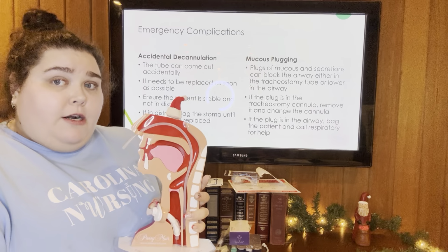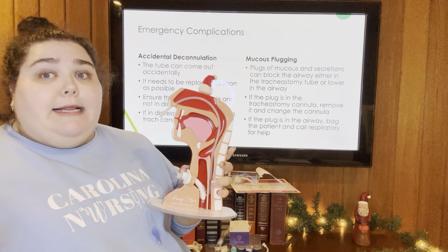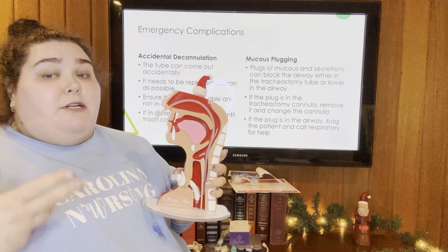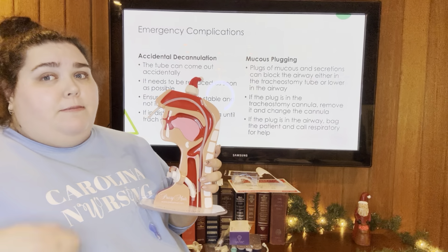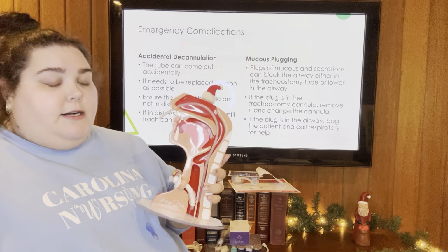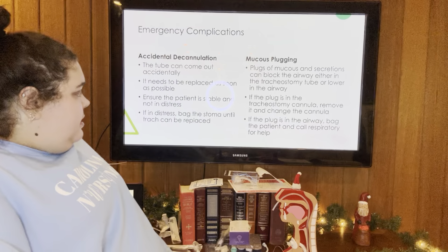If it is lower in the respiratory tract, then you'll have to suction. That is when I would recommend calling a respiratory therapist, because they're much more skilled at that kind of maneuvering. They can put a little bit of saline in there sometimes to break up the plugs and get things out, but that is something that I would let a respiratory therapist do. So we'll put Tom back there.